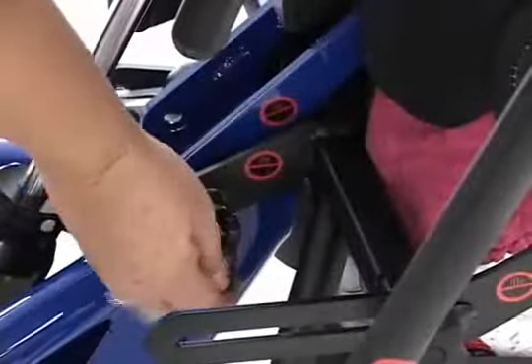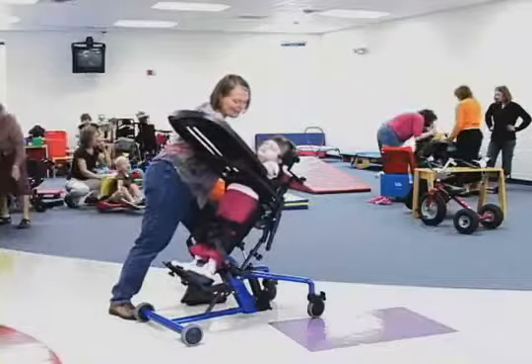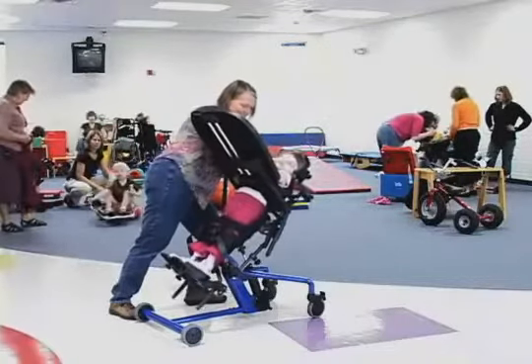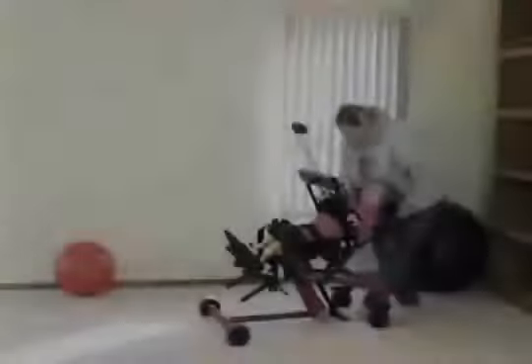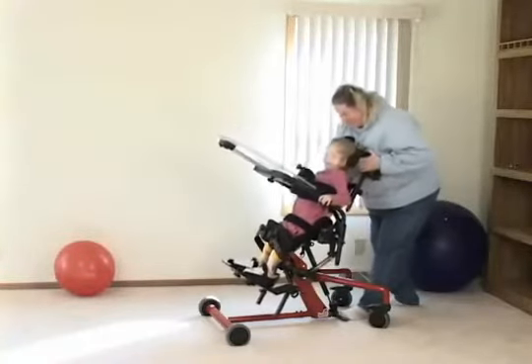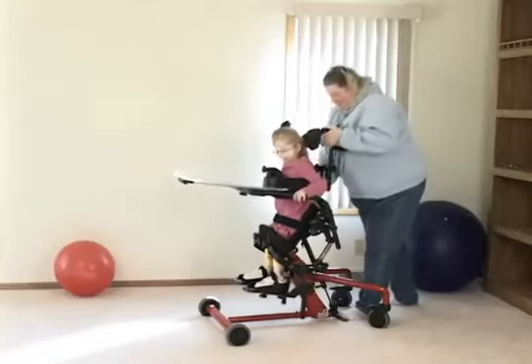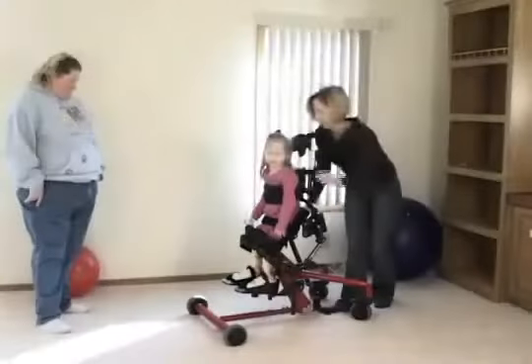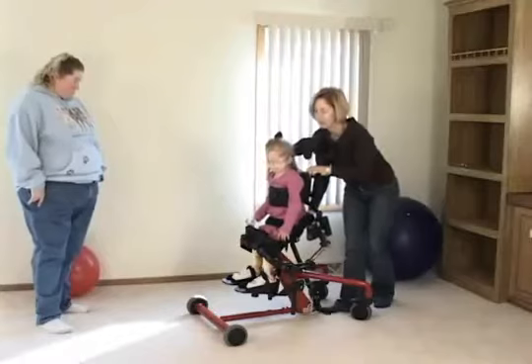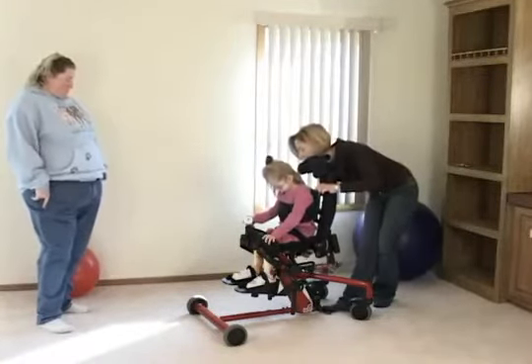Going from sit to stand to supine is as easy as flipping a lever. The supine option turns your Bantam into a true multi-positioning device. Children who are difficult to transfer due to high tone can utilize the supine option with flat-to-load transfers. Therapists will appreciate how the Bantam can be used as a supine stander now, then eventually progress to upright standing, utilizing the sit-to-stand transition.